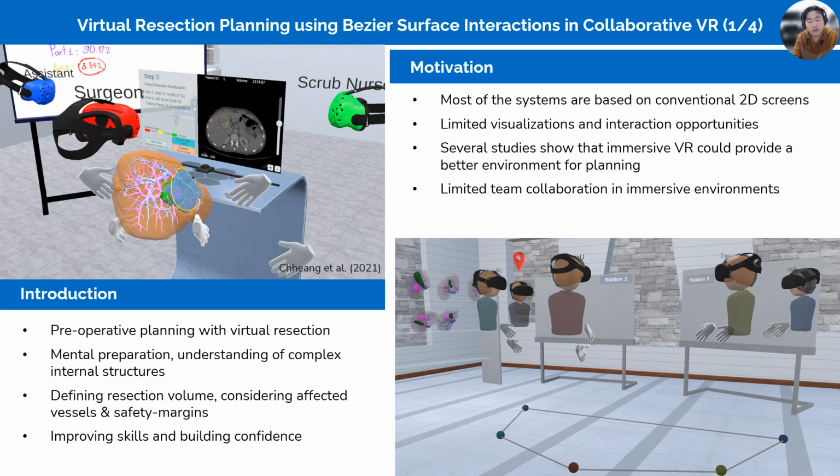However, using only a single-user VR could also offer some limitations, especially for team collaboration. So collaborative VR allows multiple users to join the same shared virtual environment, and it has been used for training the communication and collaboration among interprofessional teams.